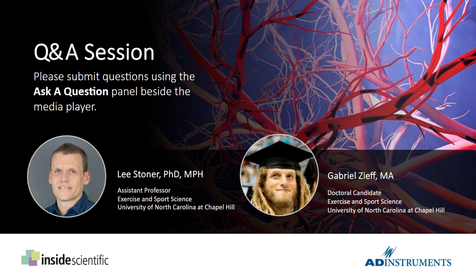So Lee, this question is for you. This person has asked, if I'm getting started with pulse wave velocity, is there a particular device that you would recommend? Yeah, that's a good question. There are a lot of devices available on the market. One of the devices that Gabe showed earlier, the SphygmoCor XCEL, is highly recommended because AtCor is probably the leader in the field and highly trusted for the quality of their assessments. That is partly tonometry based, so some degree of training is required. Another good recommendation, I really like the Vicorder, which is completely oscillometric and requires a low degree of training.